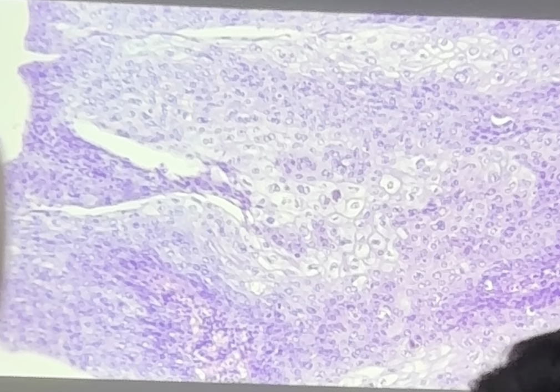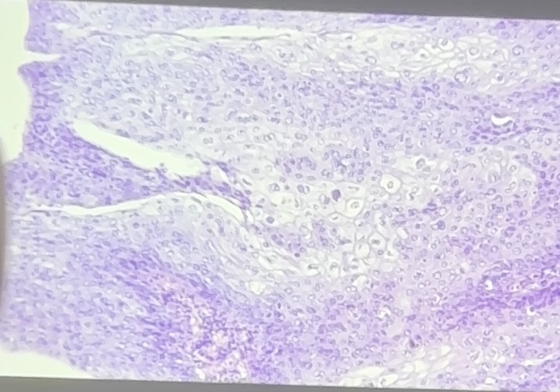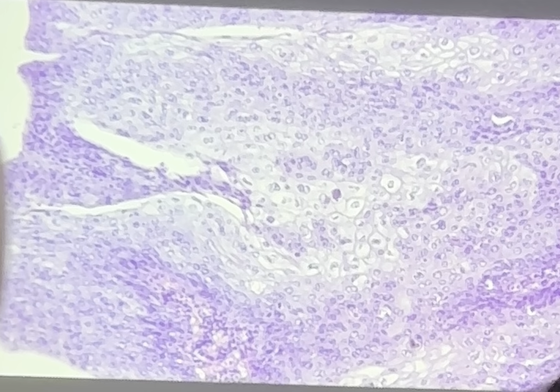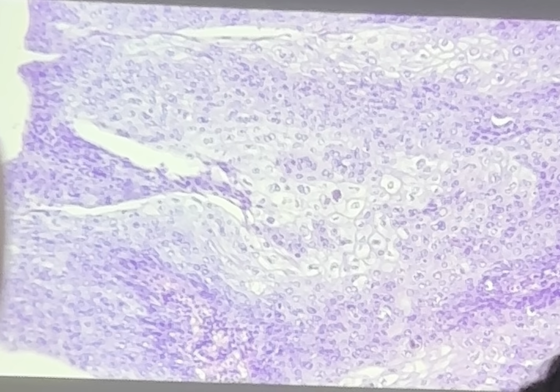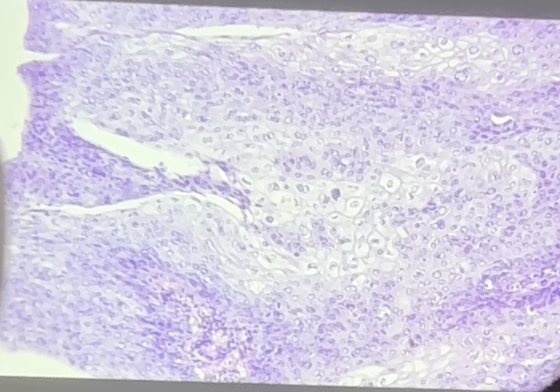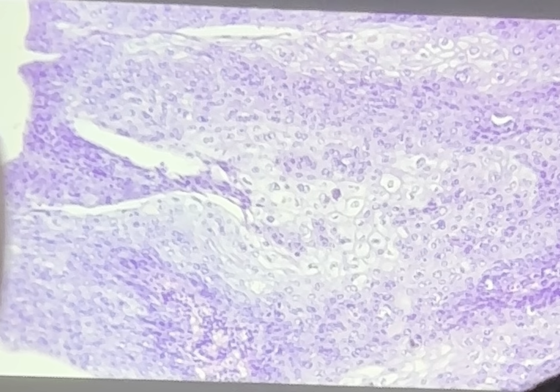Now it's the diagnosis. So we know that koilocytes, we see HPV. So you can use the medical term or the layman's term. Genital warts, layman's term. Or, this could be specific, condyloma acuminatum. So that's a sexually transmitted disease. This is near the anus. So you can guess how he got this one. Okay. So that is a sign of HPV, the koilocytes. Genital warts.